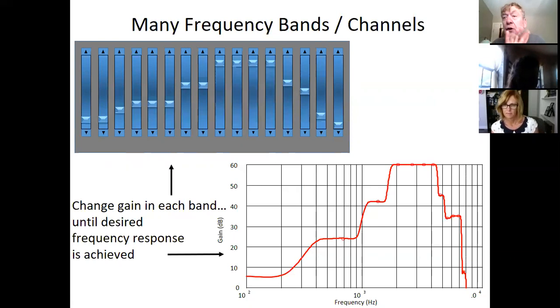And no longer is each channel an amplifier, as Tina mentioned about the 2-channel Bill and Till earlier. Those were analog. Today it's digital. In digital, you don't need a separate amplifier for each channel. So here's the channels. 1, 2, 3, 4, 5, 6, 7, 8, I guess, and then another 8 or 9.